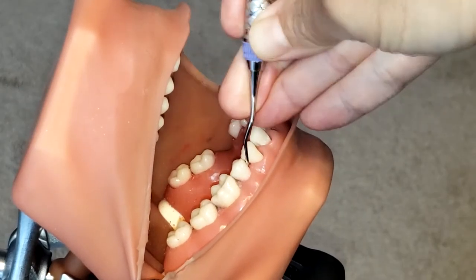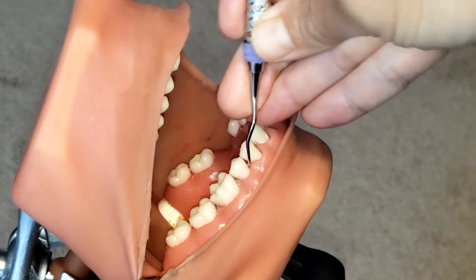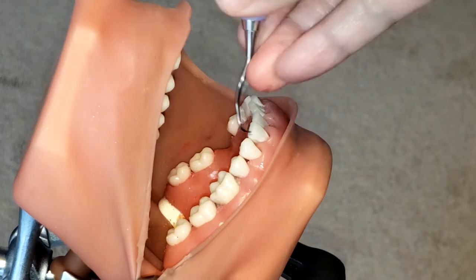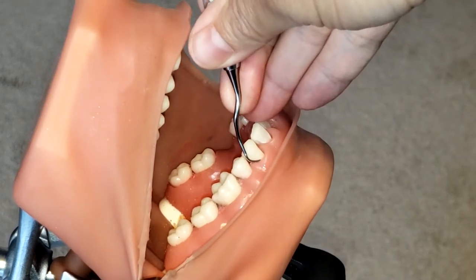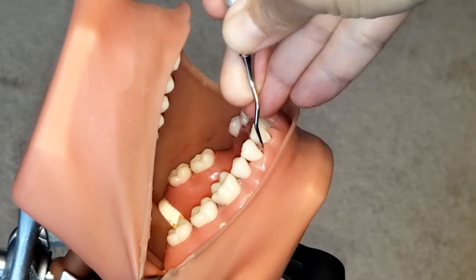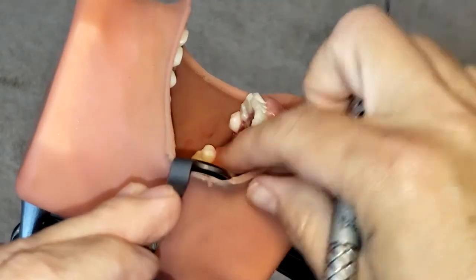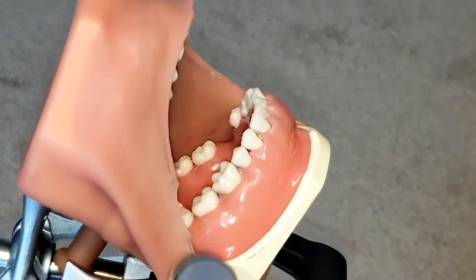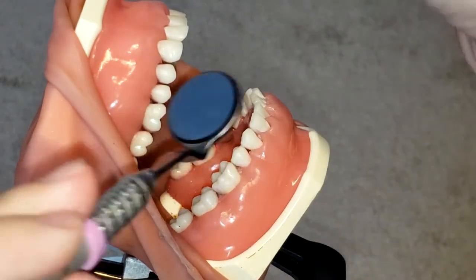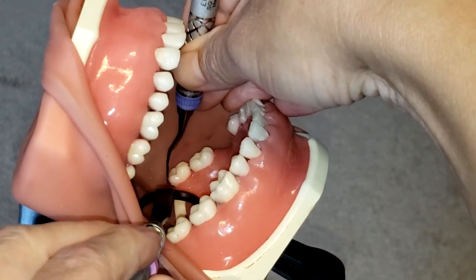You see how I'm rocking on my fulcrum and the instrument is going towards the mesial — that is for calculus removal, so you are not just going up and down with the instrument. Make sure that you are rocking on your fulcrum. Now I'm going to show you how to use it on the linguals of the lower left — again start at the distal line angle.